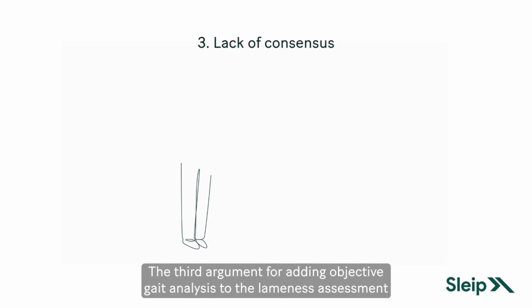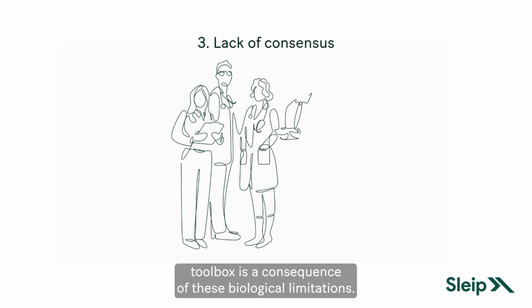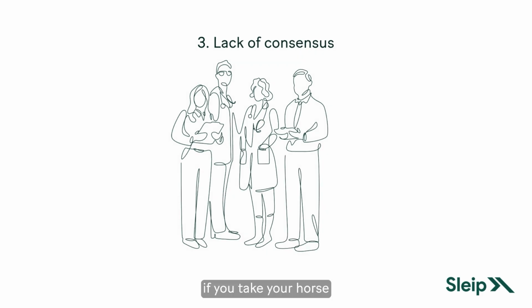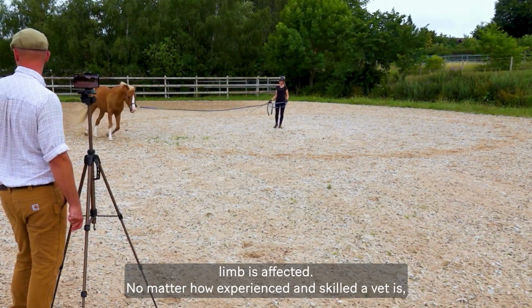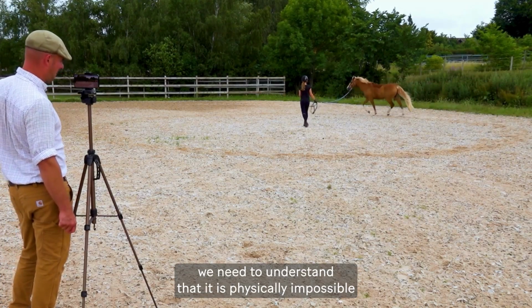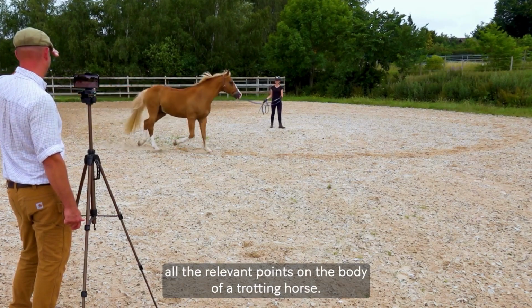The third argument for adding objective gait analysis to the lameness assessment toolbox is a consequence of these biological limitations. Anyone familiar with horses will likely have heard the saying that if you take your horse to 4 different vets, it will be lame in 4 different legs. This joke holds some truth, especially in cases of low-grade lameness. When the lameness is subtle, even experienced clinicians have difficulty agreeing on which limb is affected. No matter how experienced and skilled a vet is, we need to understand that it is physically impossible for the human visual system to track and process all the relevant points on the body of a trotting horse.